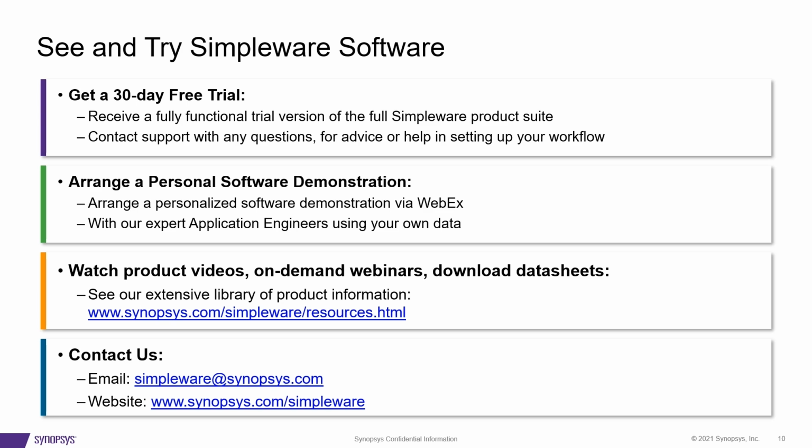The geometry of the implant has a couple of design features where we want to mimic the curvature of the knee of an average population as much as possible. We also don't want to remove a lot of bone, so we are limited with that. That's why it's a mushroom shape, not a cylinder going into the bone. That's the main reason we have that shape.